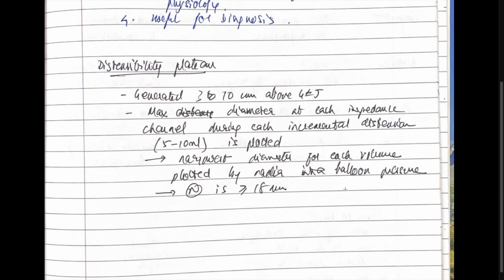Distensibility plateau is generated 3 to 10 centimeters above the GE junction, max diameter at each impedance channel during each incremental distension, that you increase the distension from 50 ml to 60 ml to 70 ml. That is plotted down. The narrowest diameter for each volume is plotted by the nadir intra-balloon pressure, and the normal should be more than 18 mm.